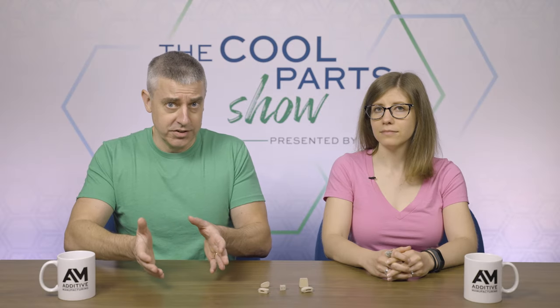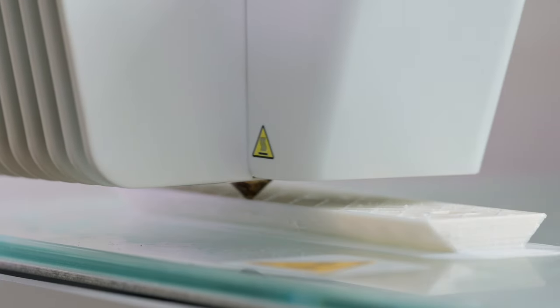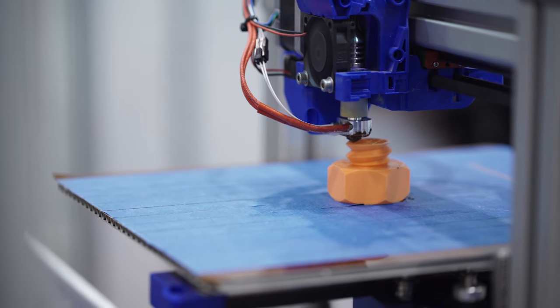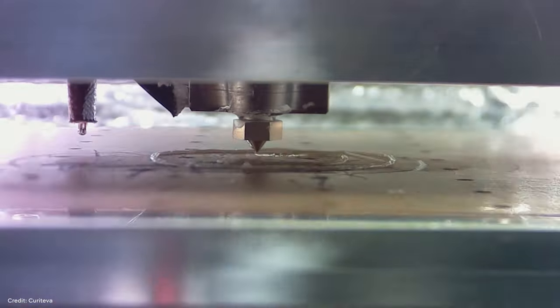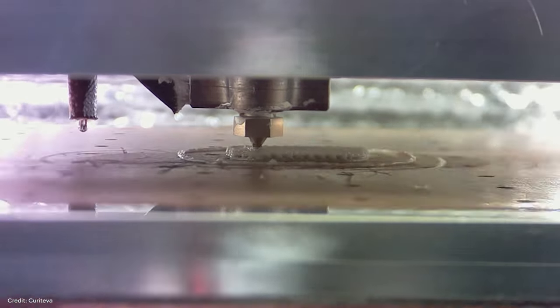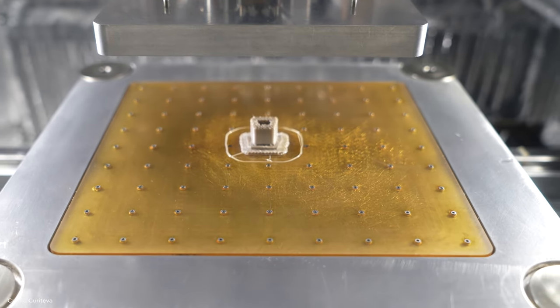Fused strand deposition. So normal deposition style 3D printing, like fused filament fabrication, is kind of like working with a glue gun. The material is melted and it is extruded in that melted form, building up the part layer by layer that way. With fused strand deposition, it is much more like working with strands of taffy, knitting the part together with these taffy strands.